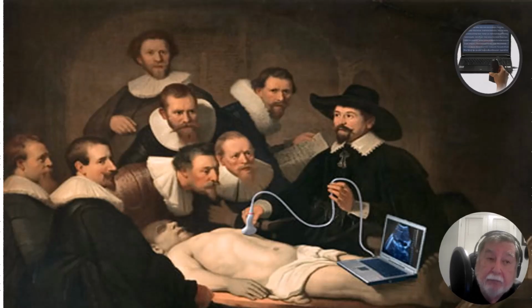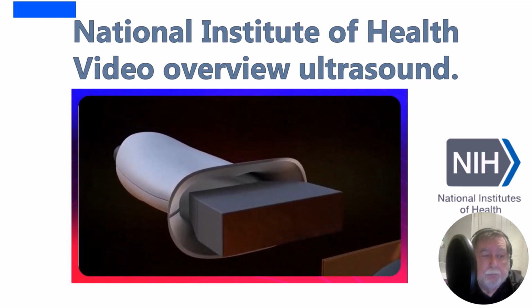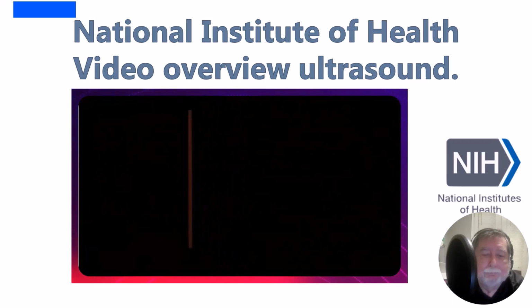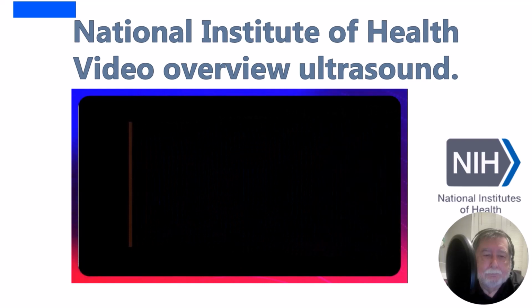at the same time. Let's listen to the National Institute of Health overview. The heart of most ultrasound systems is a device called a transducer, which uses an array of piezoelectric crystals. A piezoelectric crystal vibrates when an electric signal is applied, producing high-frequency sound pressure waves, which we call ultrasound. More importantly, this type of crystal can also work in reverse. It can produce electrical signals when it detects high-frequency sound pressure waves.